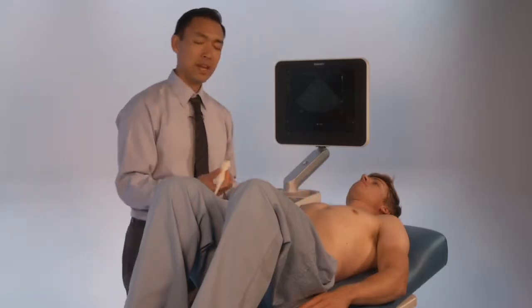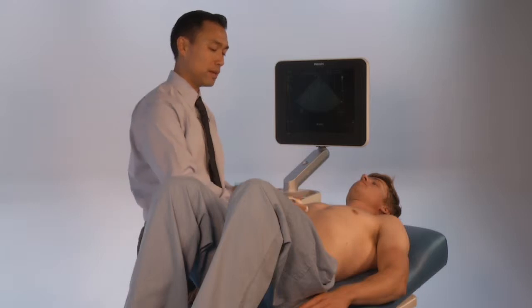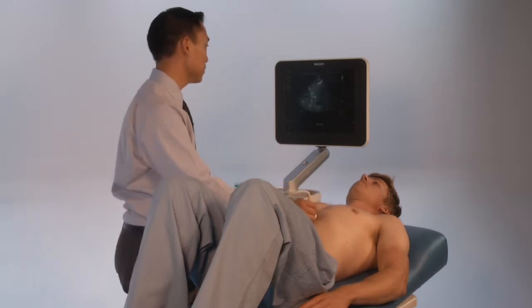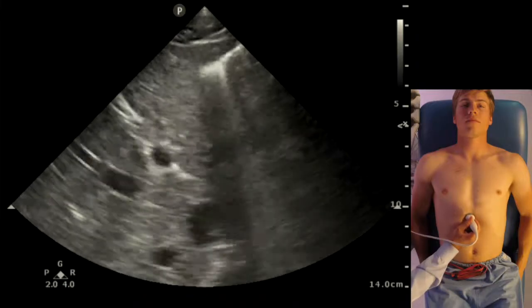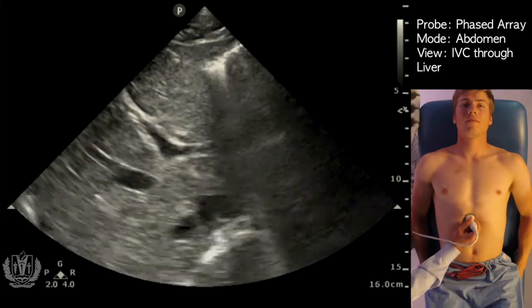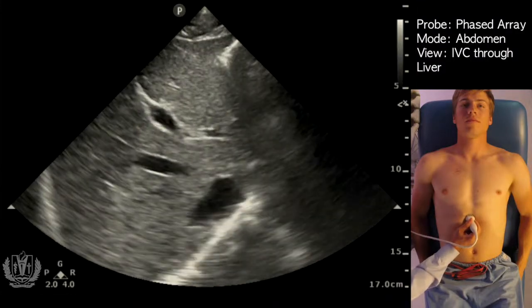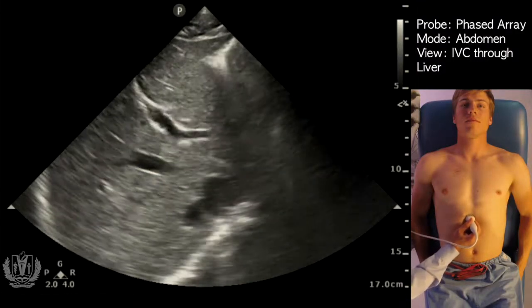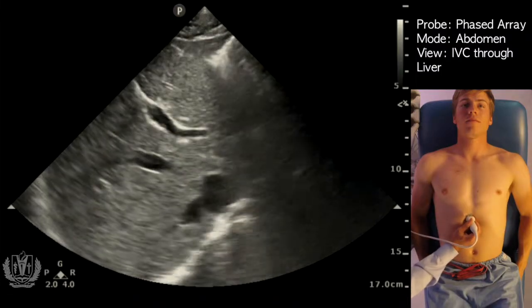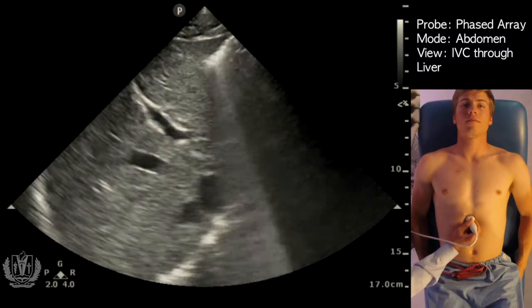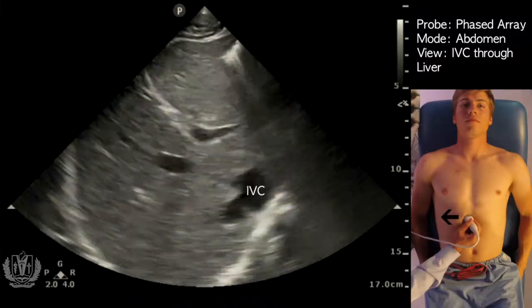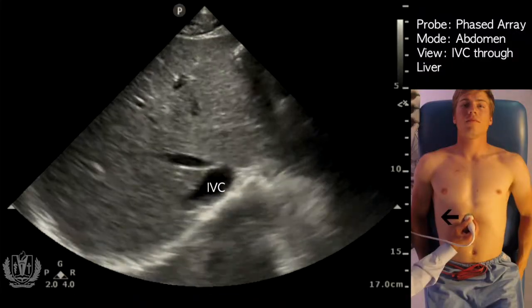In order to find the IVC, you really want to be as superior as possible, next to the epigastric area. The first thing I identify is the liver, because the IVC has to go through the liver. The IVC is usually the most posterior vessel you see in the liver, and we see it right here in the transverse view.